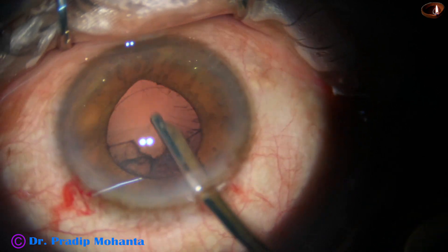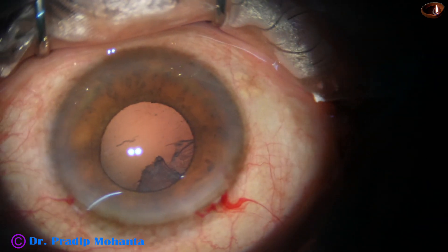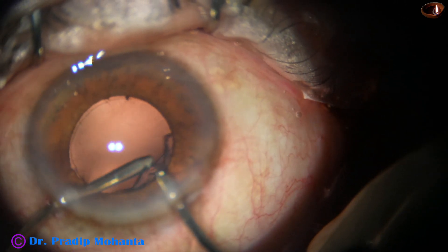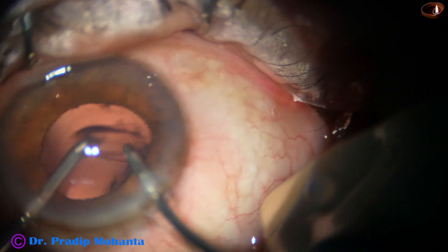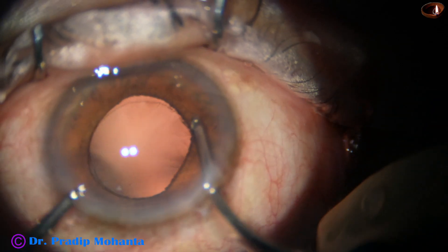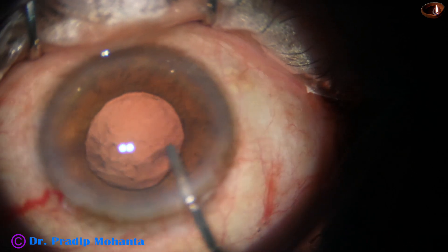I use the Simcoe cannula to remove the cortex. I then use bimanual irrigation-aspiration to remove the sub-incisional cortex. Cortical cleanup is done; a few fibers remain at 7 o'clock and 8 o'clock.